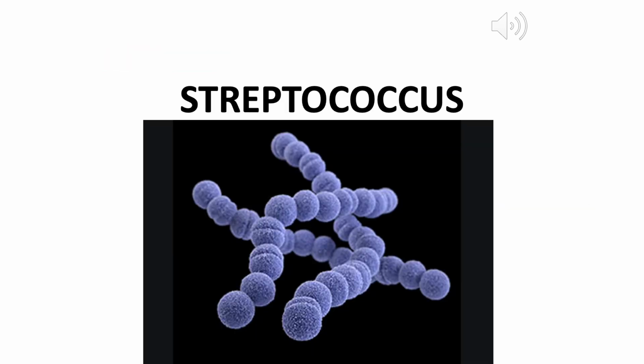Now let's move on to Streptococcus. We'll talk about some of the major species of Streptococcus and the tests to be able to distinguish them. And just a reminder again about the shape of Streptococcus. If you look at it under the microscope, remember gram-positive, cocci shaped, but the difference in Streptococcus is it forms linear chains. So remember to think of strep, strip, a strip of bacteria.